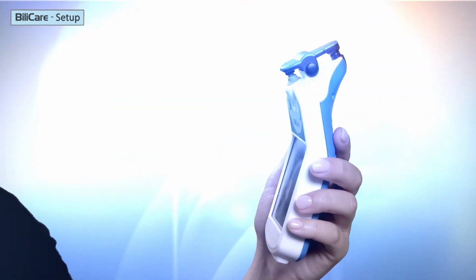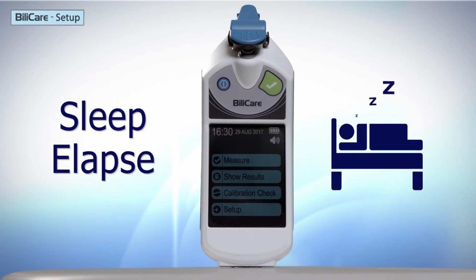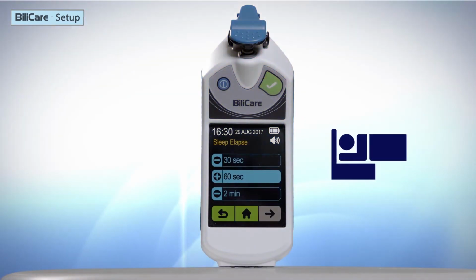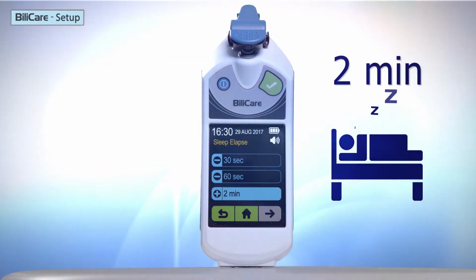The Sleep Elapse menu determines the elapsed time from home screen at reduced brightness to shutdown. Any touch on the screen will return BiliCare to full brightness and operation. The default time is 60 seconds. 30 seconds or 2 minutes may be selected.